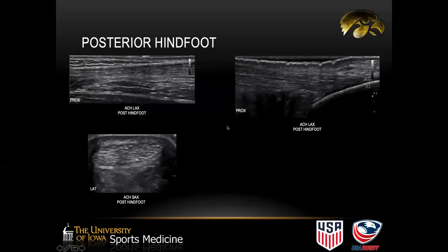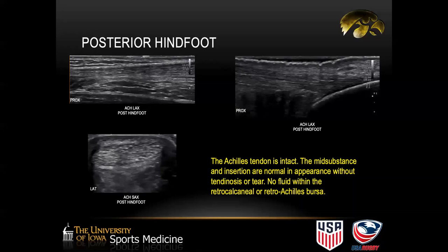I'll flip around to the posterior hindfoot for a quick evaluation of the Achilles tendon. In long axis we see the Achilles tendon with the calcaneus on the right and proximal to the left — all looks normal. We can see the Achilles mid-substance in long axis and in short axis with that normal hyperechoic fibrillar broom-end appearance. For this patient, the Achilles tendon is intact with normal mid-substance and insertion. There's no fluid within either the retrocalcaneal or retro-Achilles bursa.